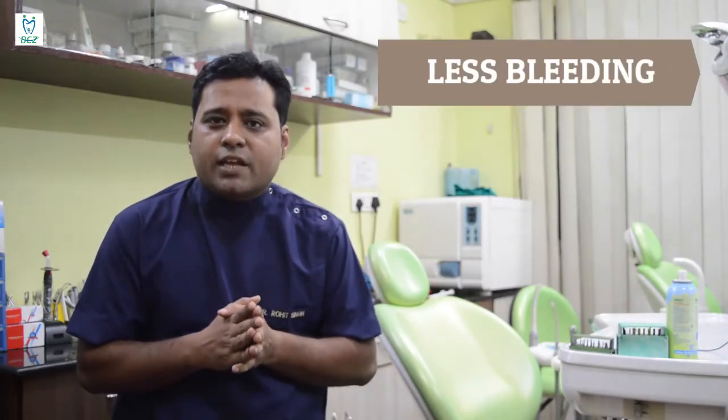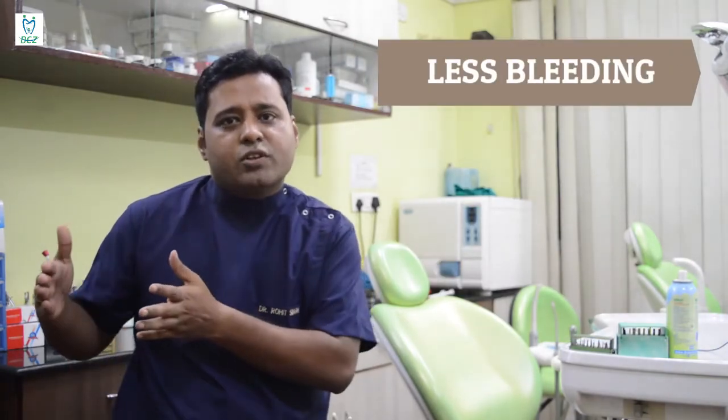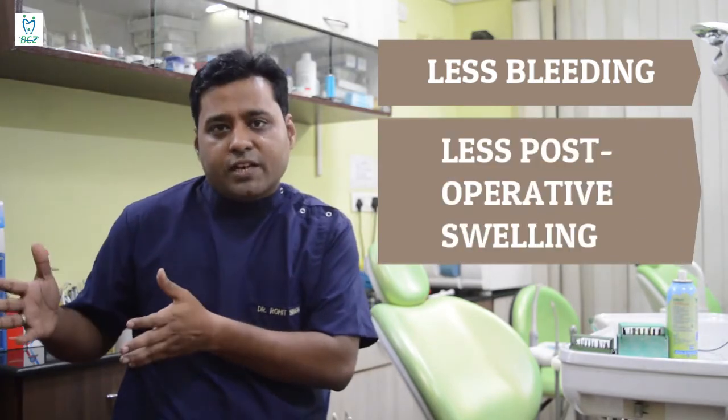Since it works on cavitation phenomena, it causes a lesser amount of bleeding. Postoperative swelling is also very less.